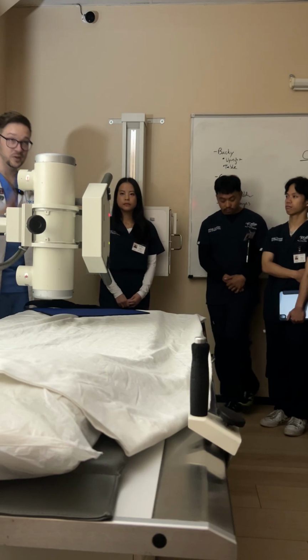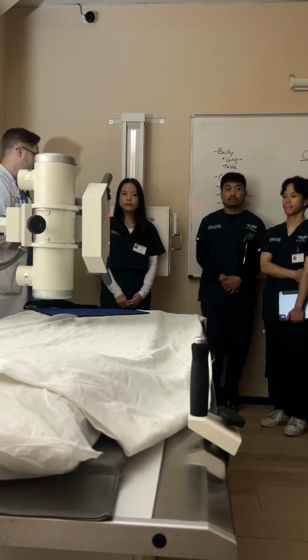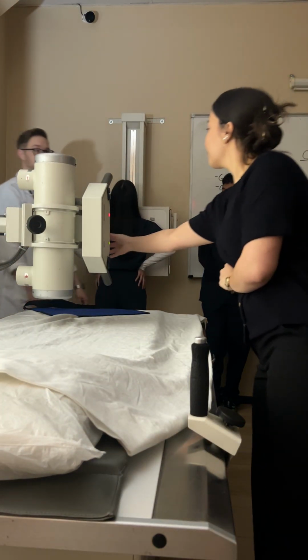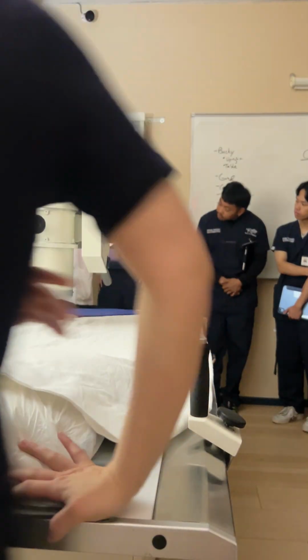But you do whatever you feel comfortable with. Again, it's in your book, okay? Let me have you turn around one more time. So she's shielded. She's got those shoulders rolled forward. She's got the hands, right? We are centered where? So we're on T7.